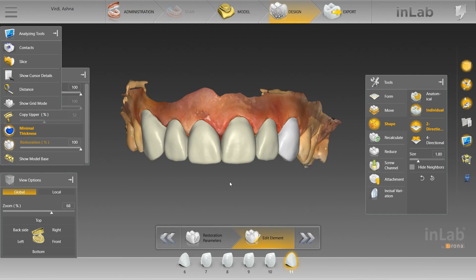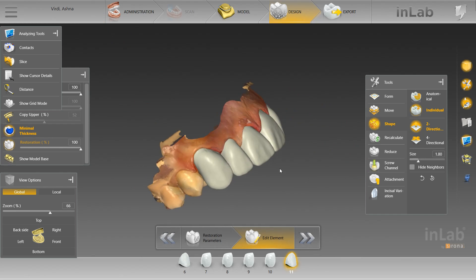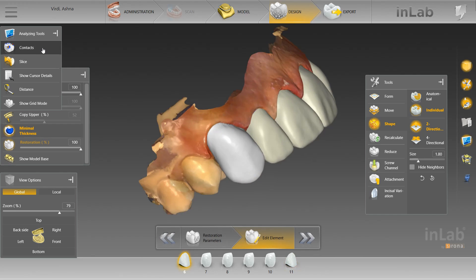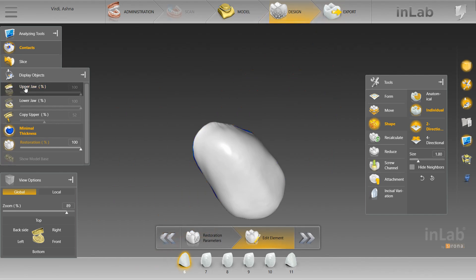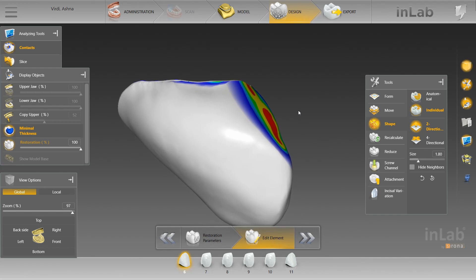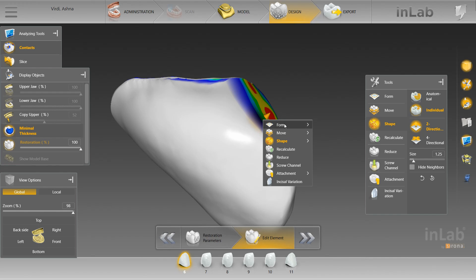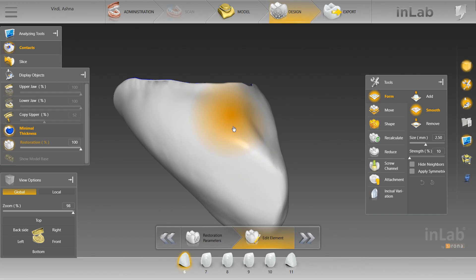Now we've got the contacts — or better yet, the embrasures — how we want them. Now we're going to go in and make those contacts green, and what we're really going to focus on here is making a nice smooth surface that's green. You don't want things to be lumpy, and you can kind of see that right here — there's an indention. You want to fix all that with the smooth tool, so we're going to do that now and make everything green.